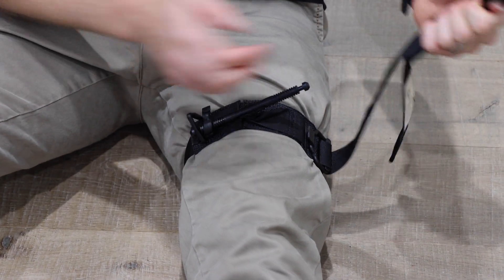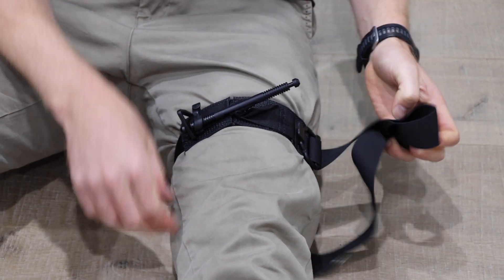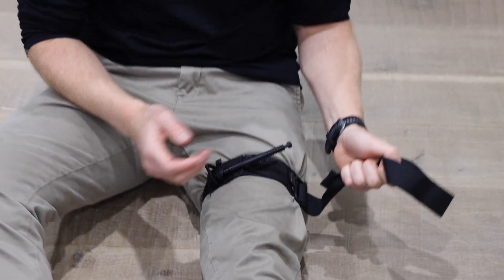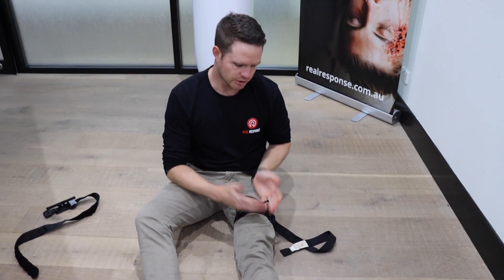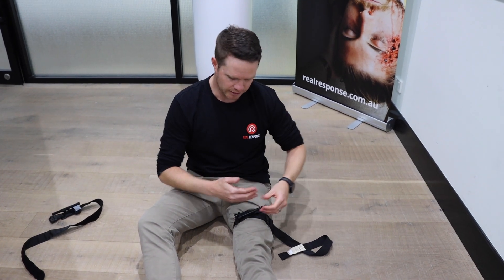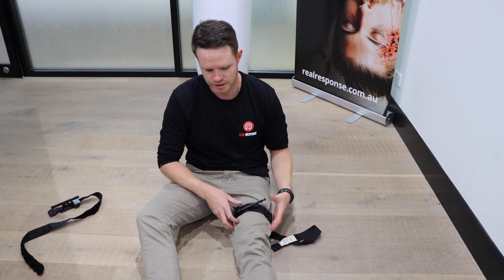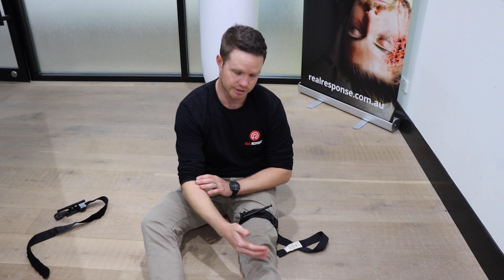We don't have the velcro to lock it on, so make sure you tuck everything in place. You don't want someone stepping on it, pulling the tourniquet loose, or it getting caught on a doorway or hanging off a stretcher. If you need to apply a second one, go as close as possible to the first one - if you can't go above, go below - making sure you're getting enough pressure on those tissues.